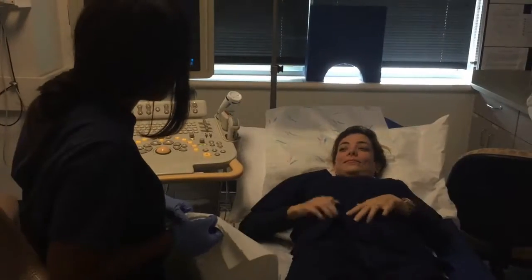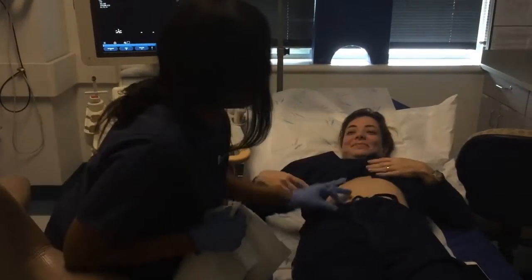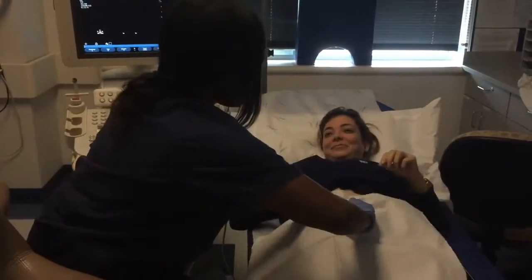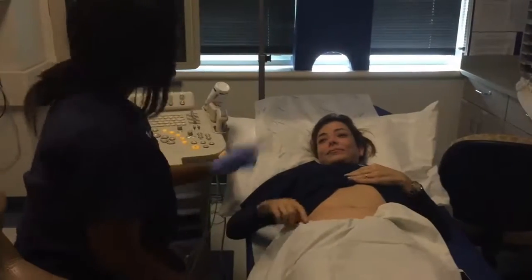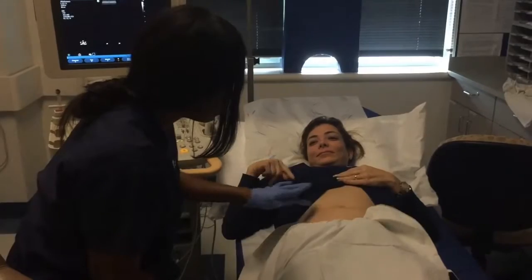When a patient presents with right lower quadrant pain suggestive of acute appendicitis, the sonographer should ask where it hurts and start scanning at that location. An inflamed appendix can be seen 90% of the time. The patient will also have an elevated white blood cell count, fever, nausea, and vomiting.